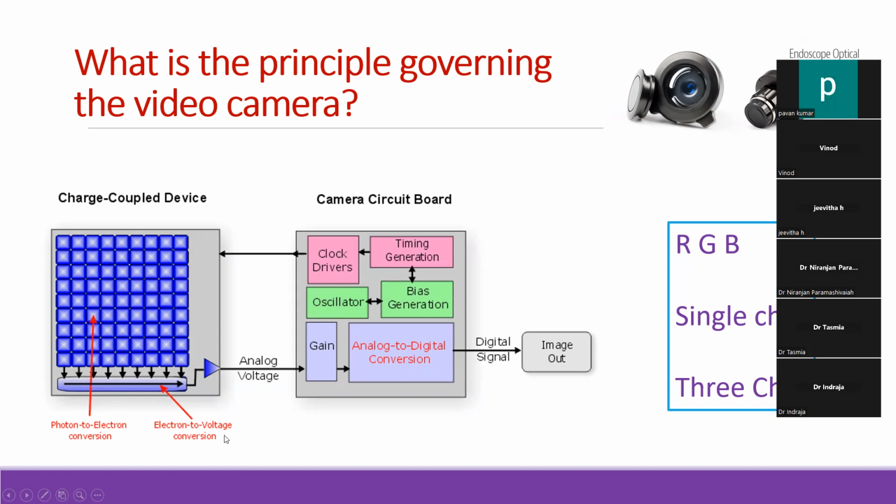Each of those is read by the machine as a particular dot. You may have thousands and millions of colors, but they can all be reduced into RGB, red, green, and blue, 3 basic colors. The various combinations of these 3 give you so many other colors. That gives you the hue, the saturation, and the color. The light gives you the brightness.